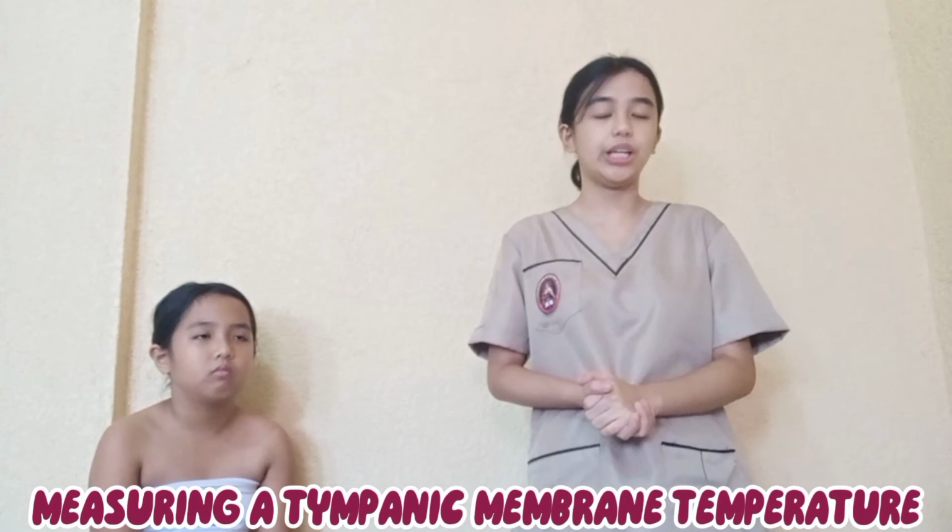So let's now proceed to the measuring of tympanic membrane temperature. Since I do not have equipment, I will just cite the procedure. If necessary, push the on button and wait for the ready signal of the unit. Next, slide a disposable cover onto the tympanic probe. Next, insert the probe snugly into the external ear using gentle but firm pressure, angling the thermometer toward the patient's jawline and pulling the pinna up and back to straighten the ear canal in an adult.